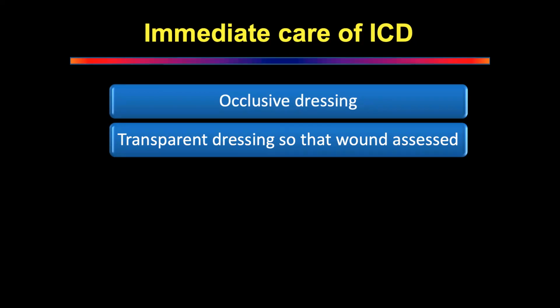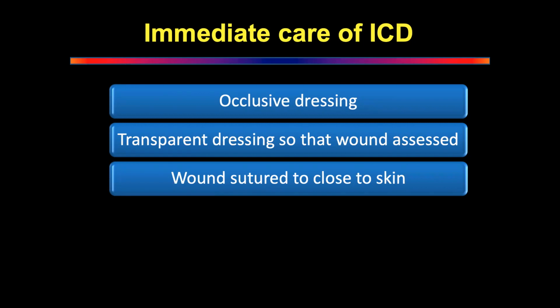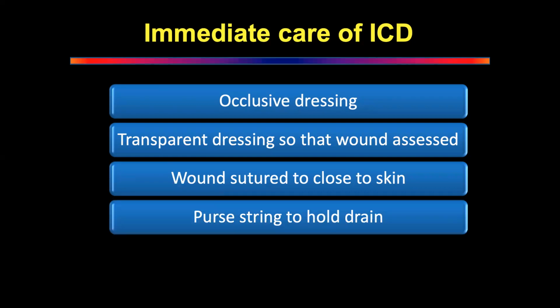Yeah, it's important. So if you know that this is going to be empyema for 5-10 days, then it's better to put a transparent dressing so that you can see the wound. Okay? All right. The wound is sutured to close the skin, with a purse string to hold the drain.